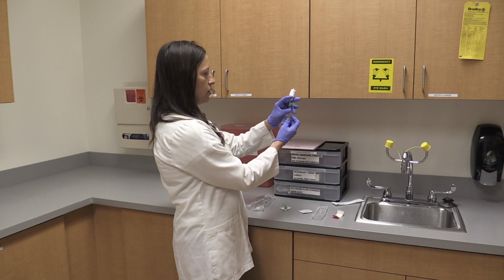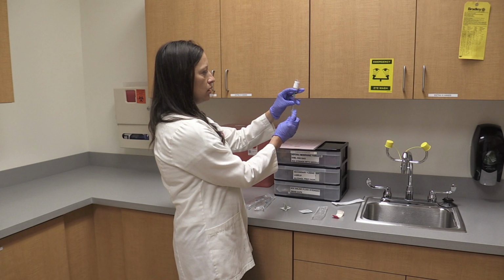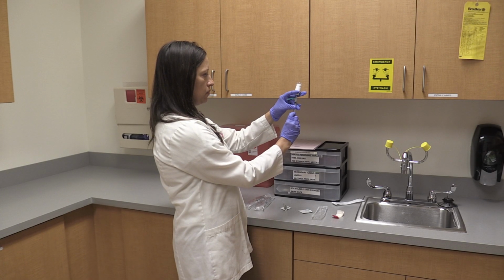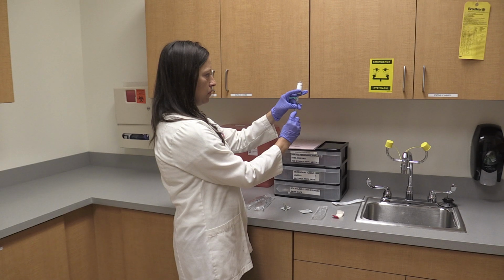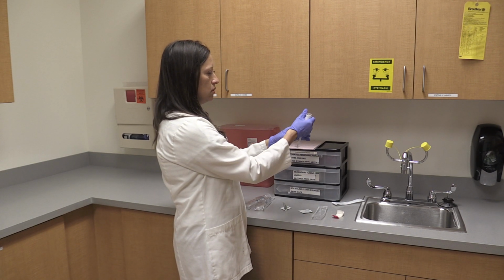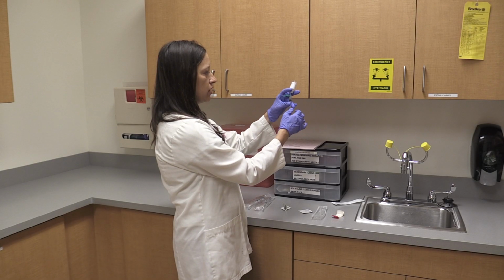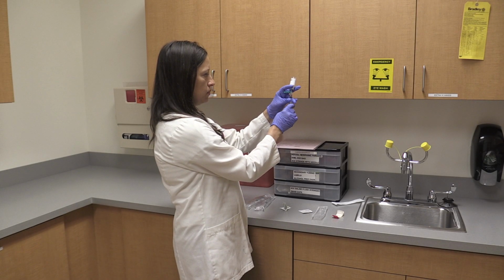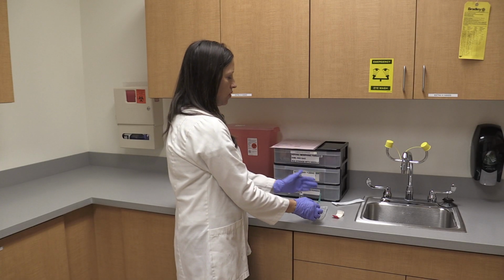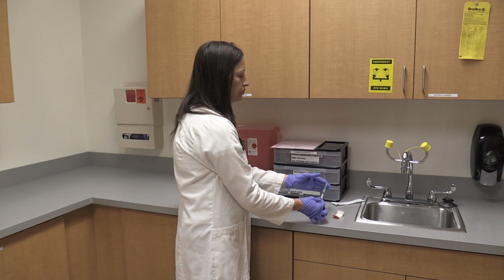I'm going to flip it over, and I'm going to pull out the half ml, making sure that there are no air bubbles or any air space in there that would affect the dose. Okay, so there's my half ml, and then I'm going to put the cap back on it.